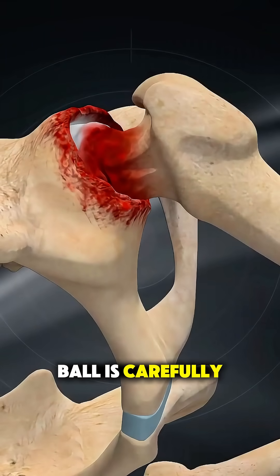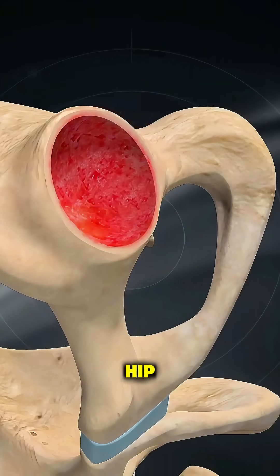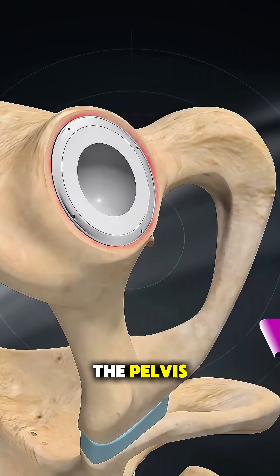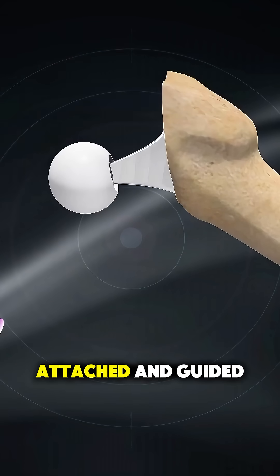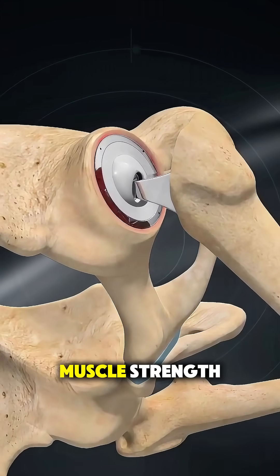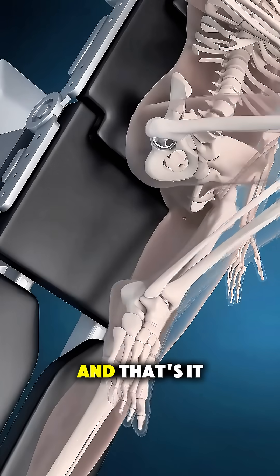The damaged hip ball is carefully removed while keeping the joint stable, and the hip socket is prepared without dislocating the hip. A new artificial socket is placed precisely into the pelvis, followed by a strong stem positioned inside the thigh bone. Then a smooth new ball is attached and guided back into the socket, all while preserving muscle strength. The surgeon checks movement and stability, closes the incision, and that's it.